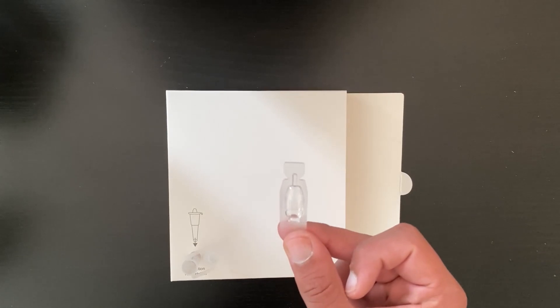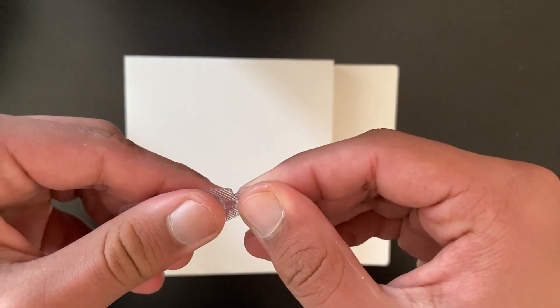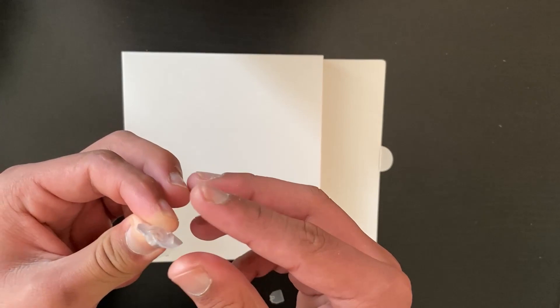The next thing we need to do is open the buffer solution, and you can do that by twisting the top end like this. Now we need to pour that into the extraction tube.